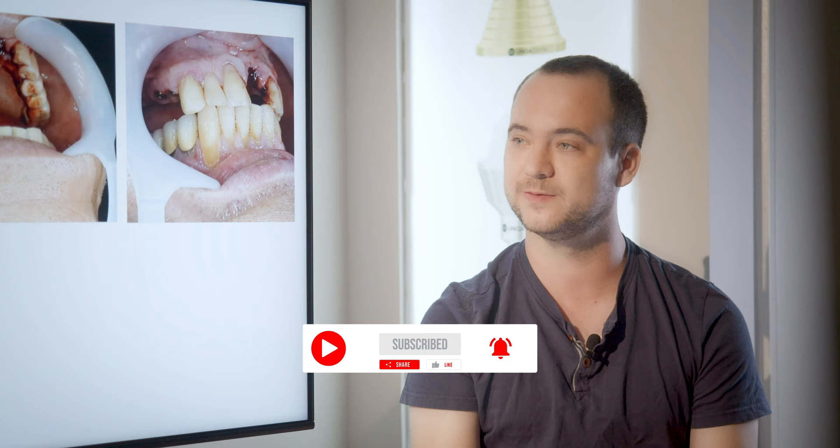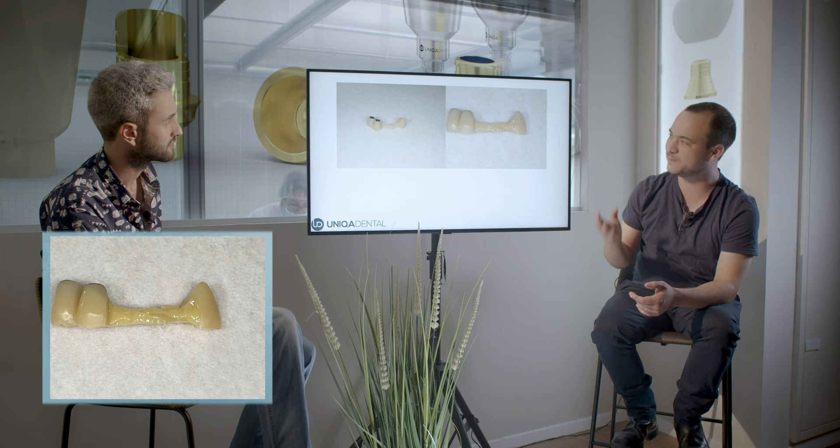You just need the restoration to not interfere with the gingiva. You can see the space — we took off the bridge and he's missing one tooth. Now let's look at how this screw-retained Maryland bridge looks. You can see two abutments, two sleeves for those two crowns with the multi-units. We added a little bit of composite to fit exactly with the contour of the teeth, and we have the missing tooth — this is the tooth we want to restore temporarily. Later on when we take it out, this composite will stick to the temporary bridge and come out as one piece. And if we want to return it, we can always do so just by reinserting the screws.